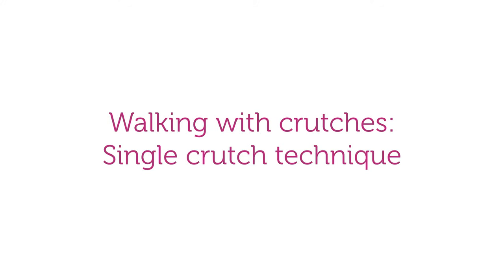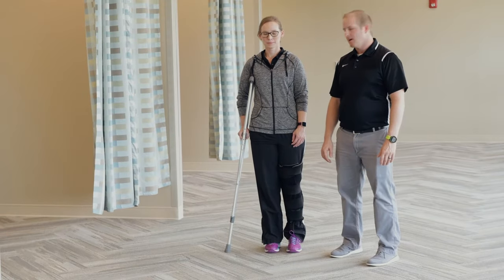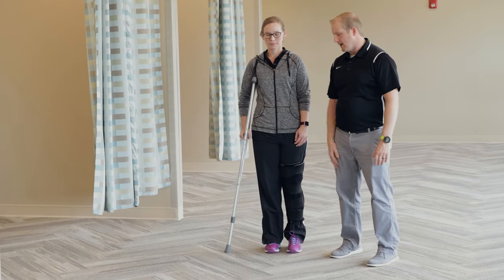The following demonstration will teach you how to walk safely using a single crutch. It is important to note that when using a single crutch to ambulate, the crutch will be on the opposite side as your affected limb.